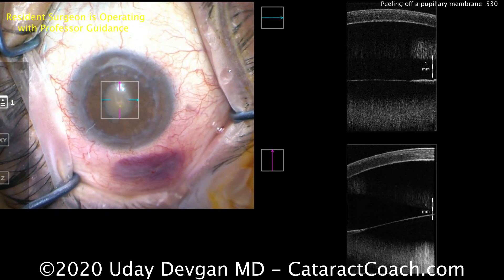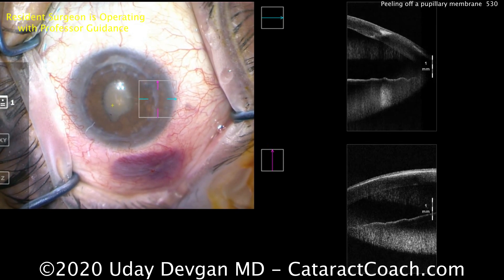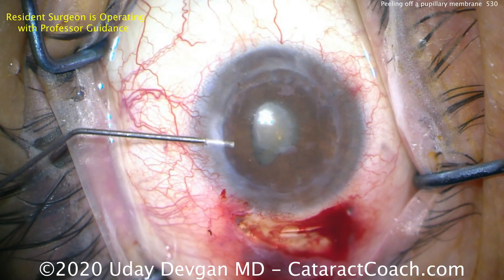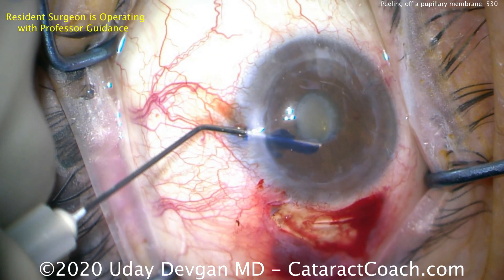There's a membrane from one edge to the other edge of that pupil, so we'll definitely have to peel that off. Going to the angle here, you can see the graft-host junction on the cornea, and the angle looks pretty reasonable and open. We're going to put some trypan blue dye in, and there's one spot where there's no membrane, so we're going to go under that.